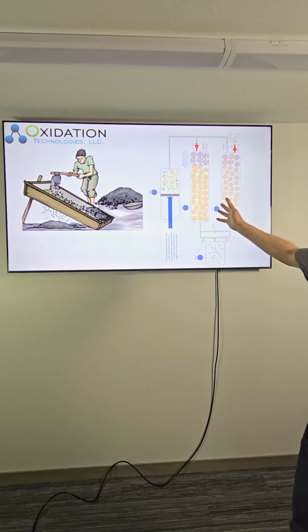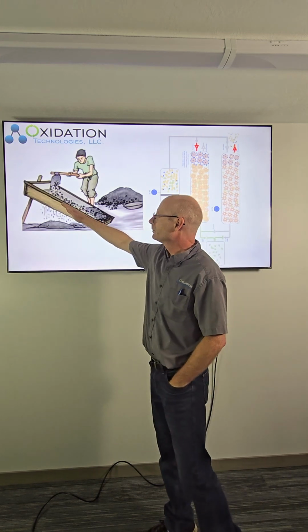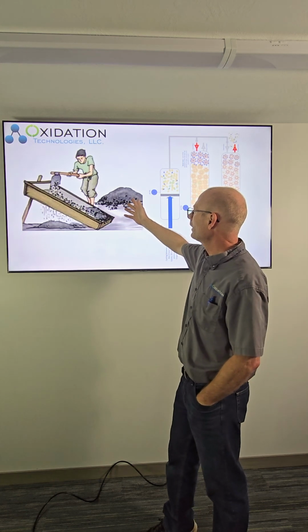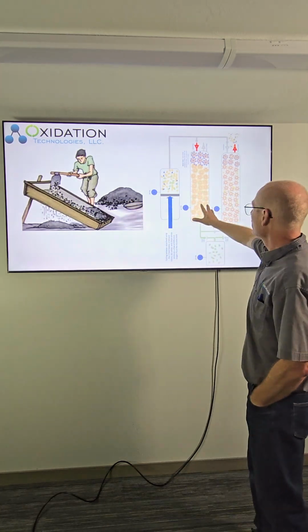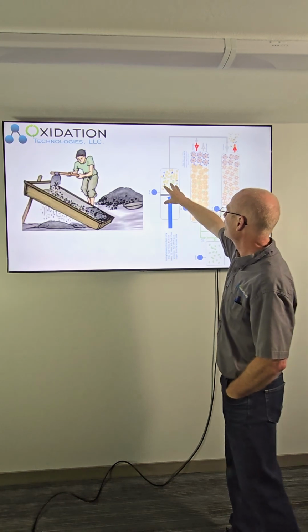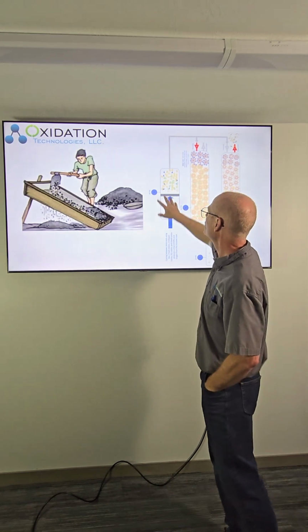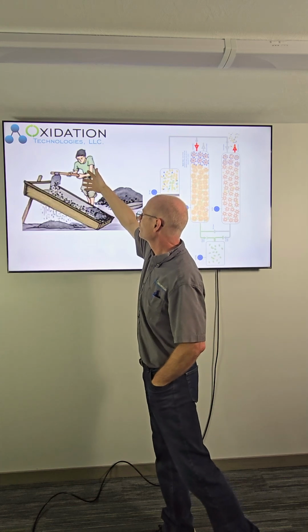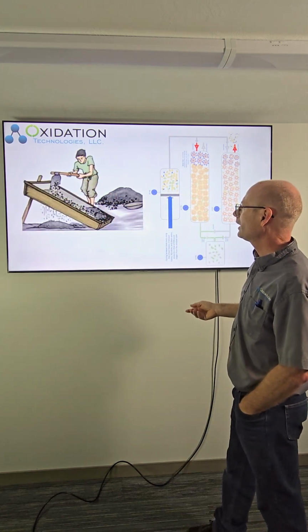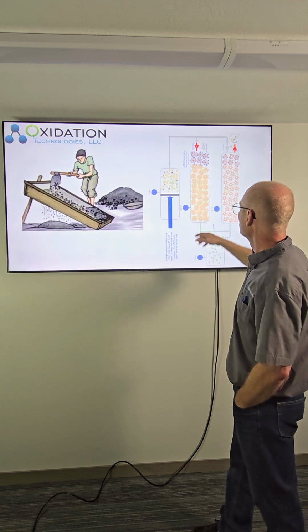So come back to this sieve. This is just another diagram of a sieve. Sieve's been used a long time, and I turn this on its side. You really have the same principles here. We've got a compressor, somebody doing the work, pushing this air in. Here's your compressor. He's lifting this material, putting rocks and sand into the sieve.